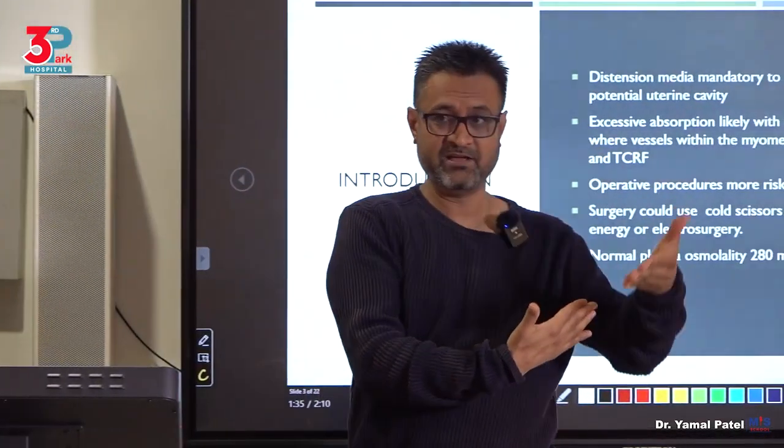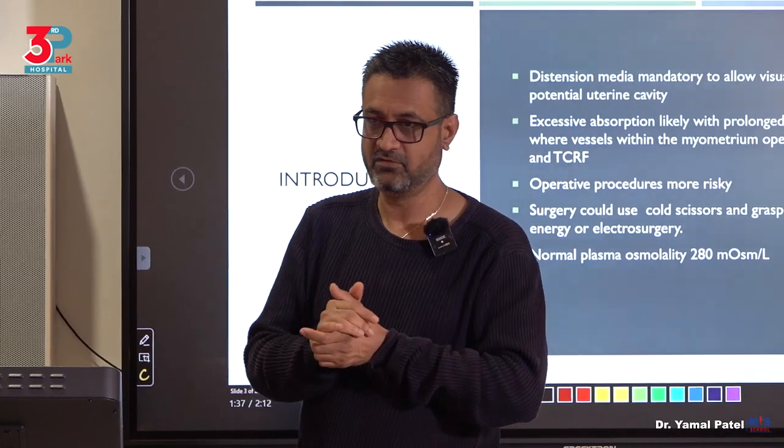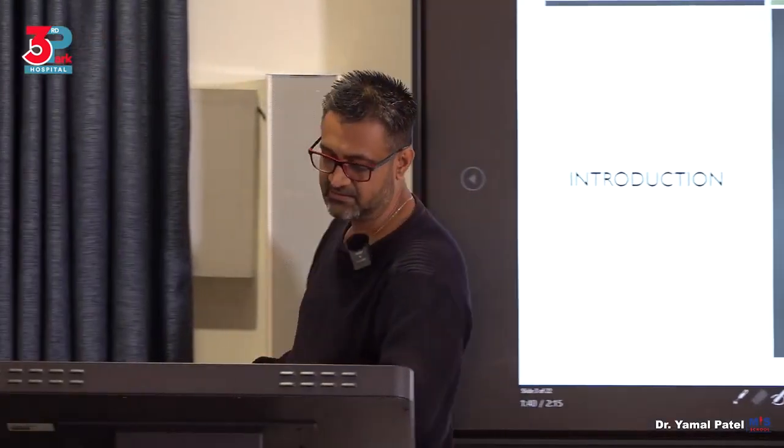And it's more risky in operative procedures than diagnostic procedures, where you're causing a break in the endometrial myometrial junction. So the moment you go beyond the endometrium into the myometrium, you're opening up vessels. Got it? And this surgery can be done in hysteroscopy using cold scissors, graspers, energy, electrosurgery. Okay? The normal osmolality of plasma is around 280 milliosmoles per liter.